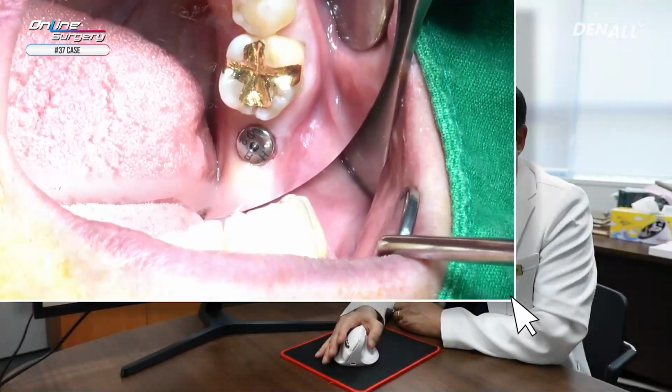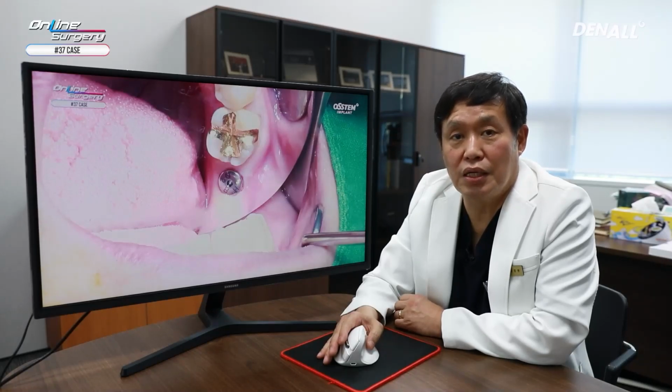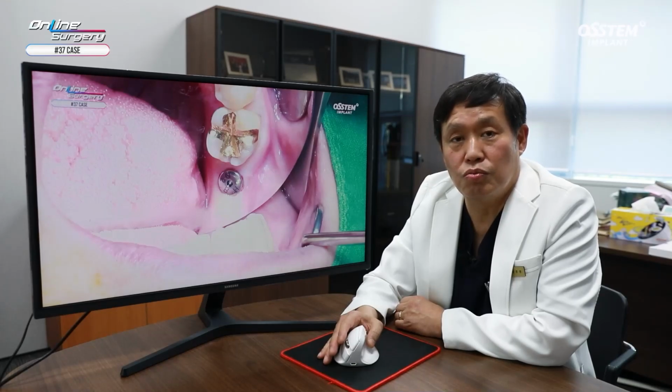Today's clip was simple, but to give you a tip or two, as shown earlier, when you do initial drilling, if it is not fully drilled up to the stop, this is because the contact with the bony tissue is not done properly. Therefore, you need to use flattening drill to remove the bone tissue on top to be able to drill initial drill fully. In the case of TSA implant, there is tendency to place implants deeper.